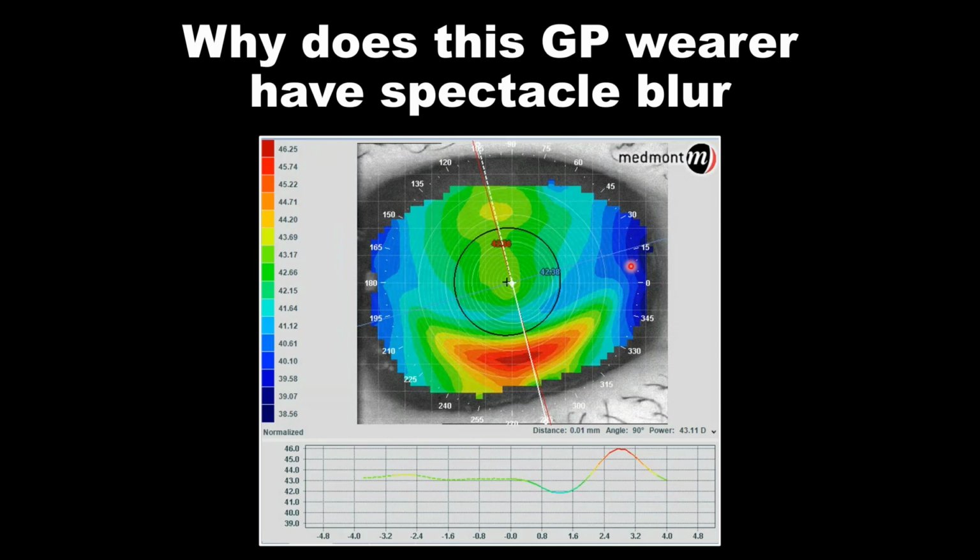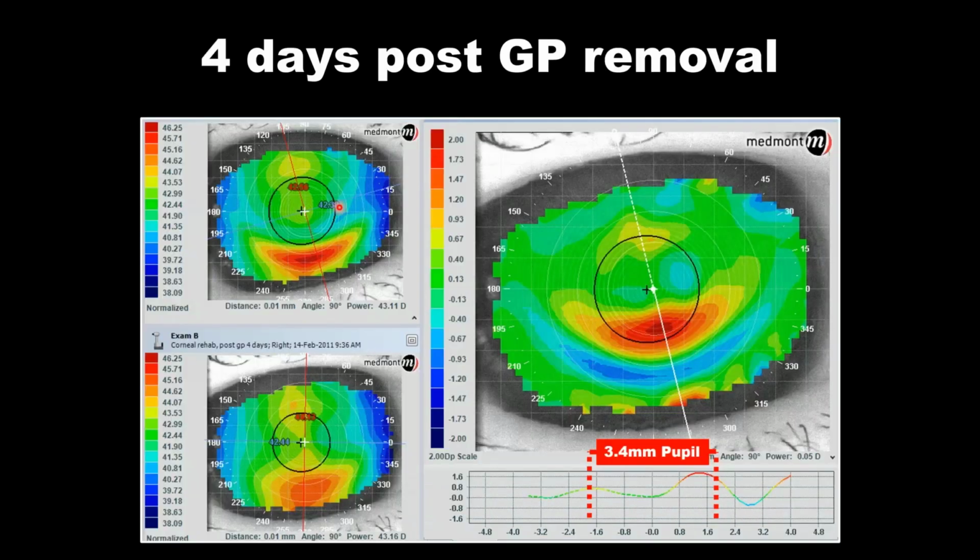disease-free, non-surgical eye, which this was. Well, let's do a subtraction. And when we compare post-removal of the contact lens to allowing that lens to rehabilitate over a period of 4 days, we're beginning to see a figure-8 hourglass astigmatism beginning to form. And when we go to the subtraction, you see how much action has happened in corneal change within that 4 days.